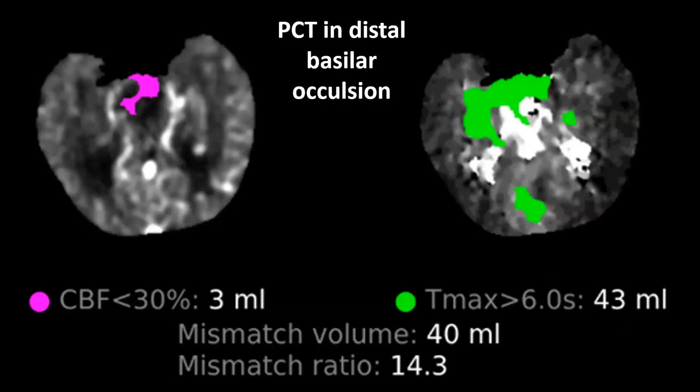Now, coming back to the question, does perfusion CT play a role in your decision to treat or not? Well, no, it doesn't. Several reasons. You will try to give your patient the best possible chance, regardless of what you see on your imaging studies. And let's look at a perfusion CT study in a patient with a distal basilar artery occlusion. What do we see according to the rapid analysis, in which the ischemic core is defined by a relative CBF lower than 30%? There's a very small core of 3 milliliters located in the pons, and then there's a quite large penumbra, I'd say, and a high mismatch ratio.